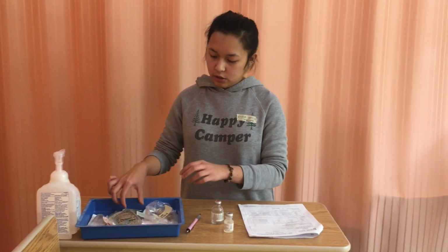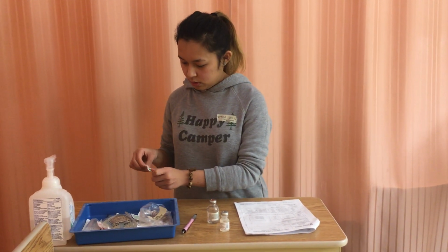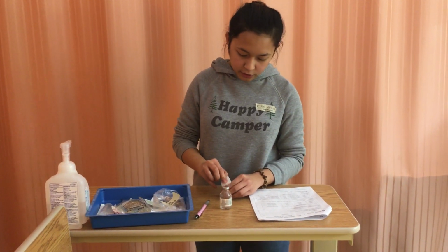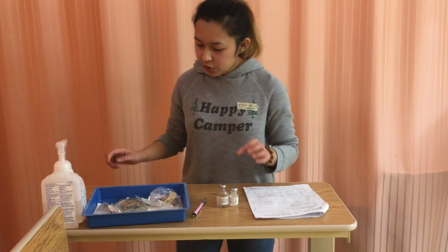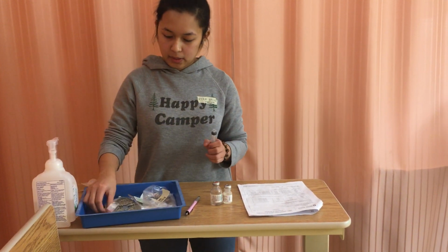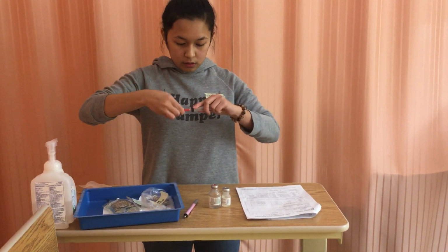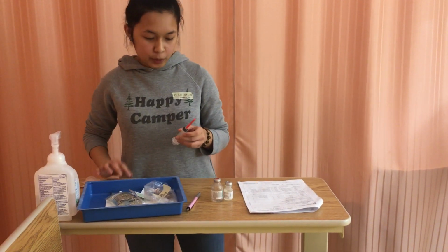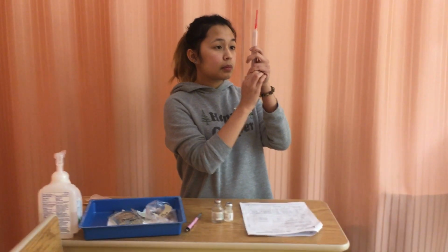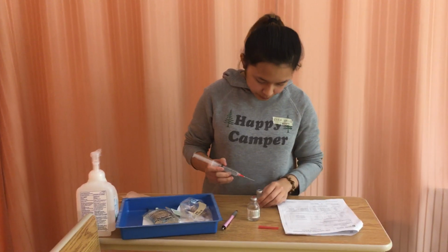Now, because it's a 5 million unit vial, I need to further dilute to 10 milliliters. So I need the vial, so 10 milliliters minus the 1.8. Swab for 30 again, let it dry for 15. While I let it dry, I'm going to set up my syringe. Grab the normal saline, make sure it's not expired. I'm going to pull up 8.2 milliliters of the normal saline. Again, attach this to my blunt fill needle, making sure to maintain the sterility of the syringe.